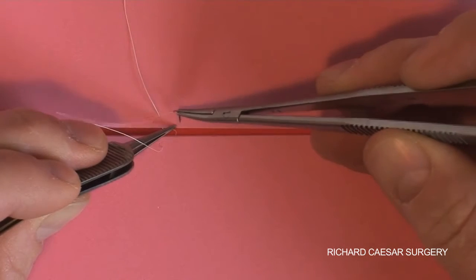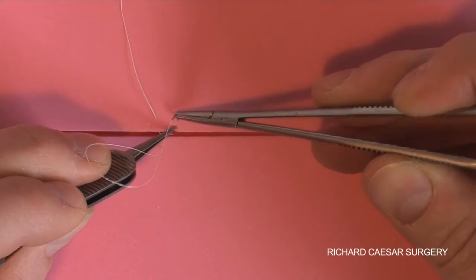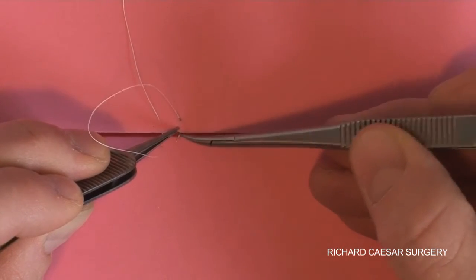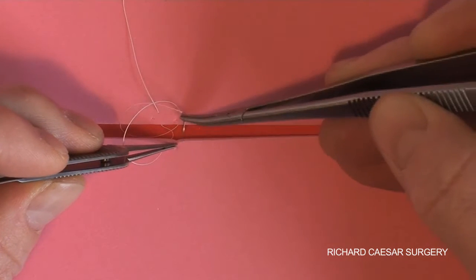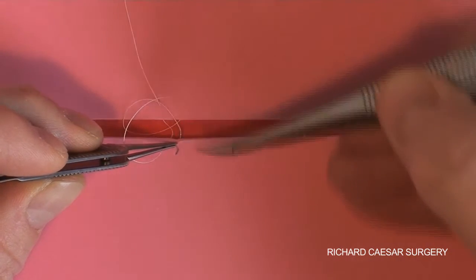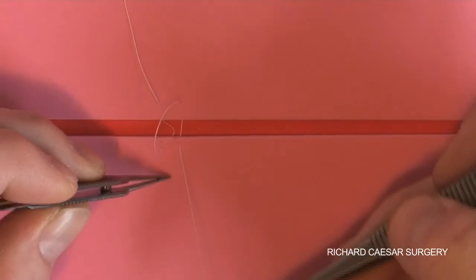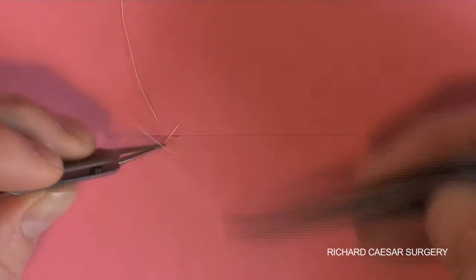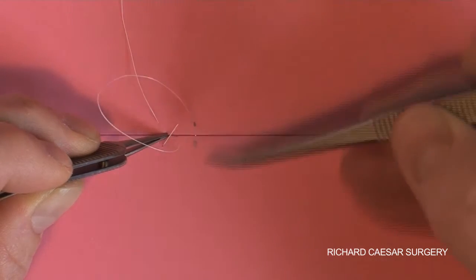So you can pick the needle up ready to go. Hold the skin edge — it's a push, a push, a pull, and a pull. Then you're absolutely ready to do another push, push, pull, and pull. This saves you the time of re-siting the needle back in the tip of the needle holder.